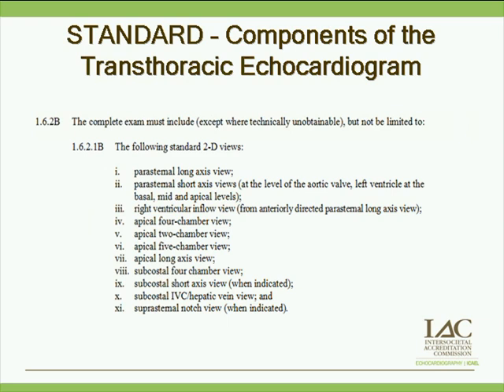And here are your views. Parasternal long axis view, parasternal short axis view, and it has to be at the level of the aortic valve, left ventricle, basal, and mid-apical views, okay? Make sure that that is also included in your protocol, you know, that nice kind of scan. Right ventricular inflow view, and this is from the anteriorly directed parasternal long axis view. Okay, so just make sure that that's in your studies and also in your protocol.